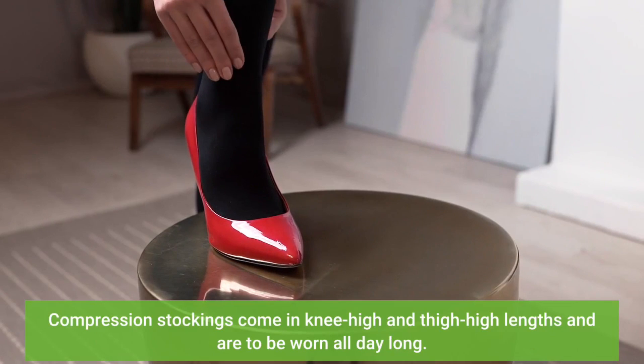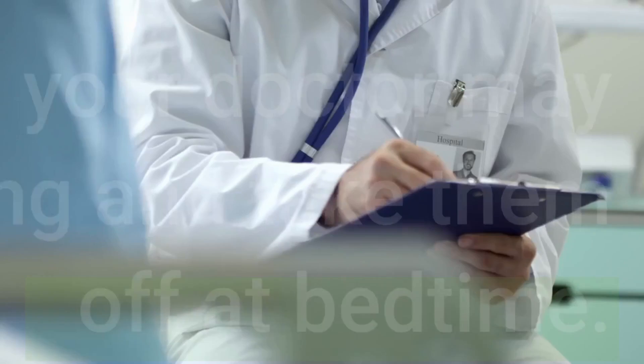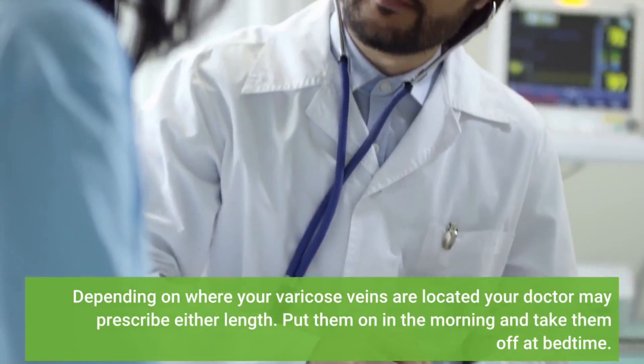Compression stockings come in knee-high and thigh-high lengths and are to be worn all day long. Depending on where your varicose veins are located, your doctor may prescribe either length. Put them on in the morning and take them off at bedtime.